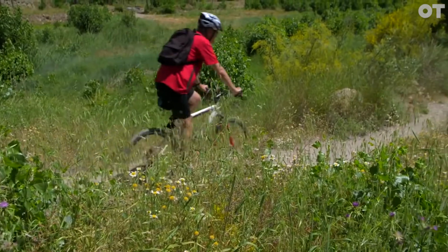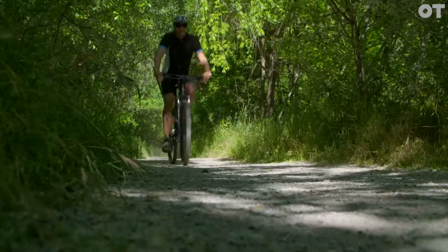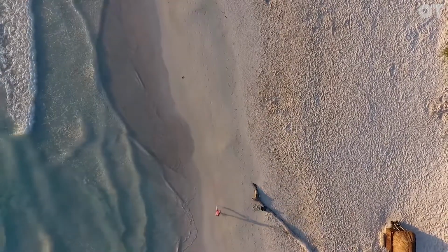It's important as the practitioner to understand the patient's lifestyle and what they're intending to use the lenses for. If they're a cyclist and they're just going to wear them at the weekends for cycling, then you might want to say daily disposable lenses. If they're a runner, then nowadays we can have reactor light lenses, so you don't have to have your sunglasses on a sunny day. And it's going to depend on the prescription as well, what lens availability there is. So not everything's available in every prescription.